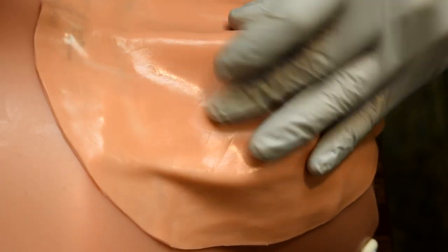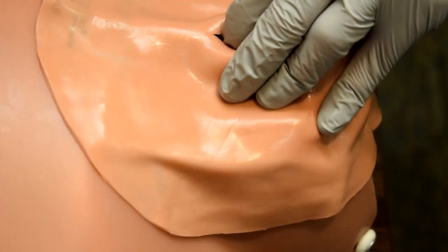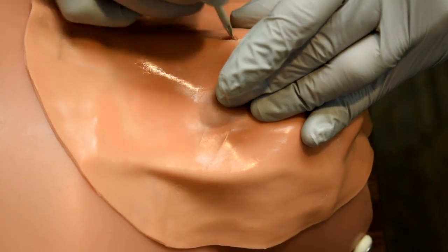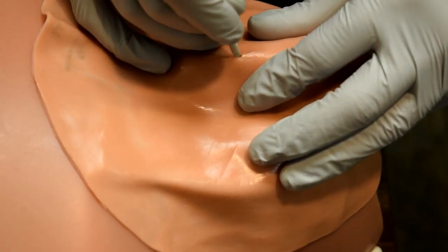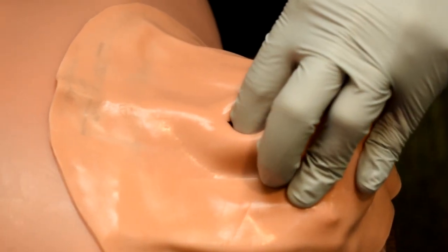and we're doing this with minimal instruments. You don't want to have to learn how to do this with a kit. You want to be able to do this with anything. So I'm continuing to cut through the layers, staying in the midline, until I feel the cricothyroid membrane. Then I'm going to stick my knife inside, and I'm going to turn it horizontally, and I'm going to puncture the cricothyroid membrane, and I'm going to cut across. At this point, I can stick my finger in and feel my finger is in the airway.